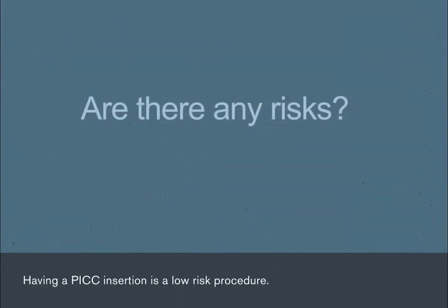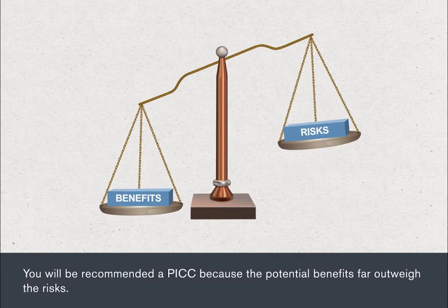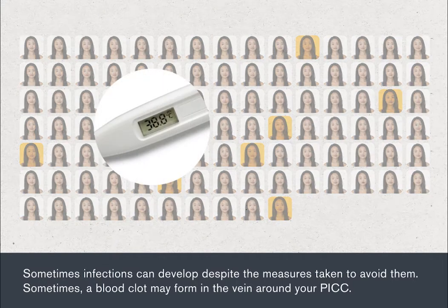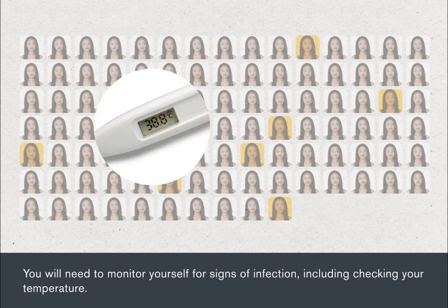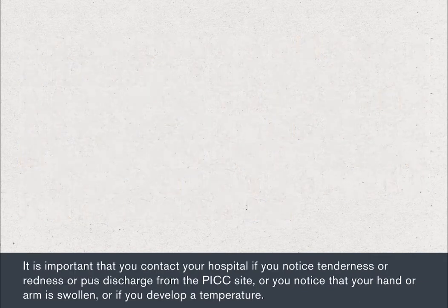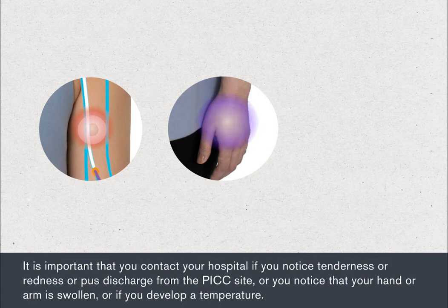Having a PICC insertion is a low-risk procedure. You'll be recommended a PICC because the potential benefits far outweigh the risks. Sometimes infections can develop despite the measures taken to avoid them. Sometimes a blood clot may form in the vein around your PICC. You'll need to monitor yourself for signs of infection, including checking your temperature. It's important that you contact your hospital if you notice tenderness or redness or pus discharge from the PICC site, or you notice that your hand or arm is swollen, or if you develop a temperature.